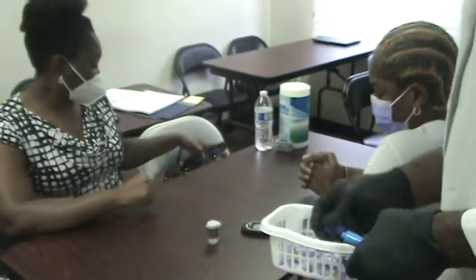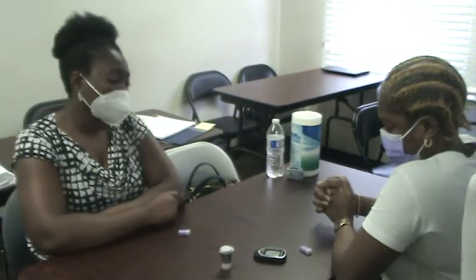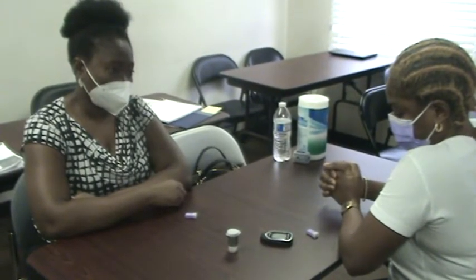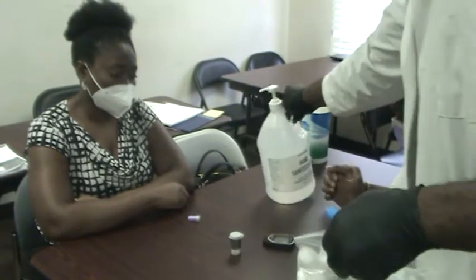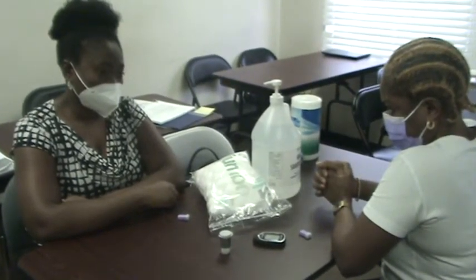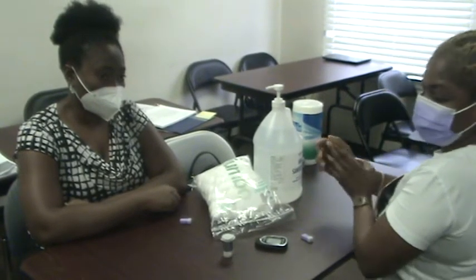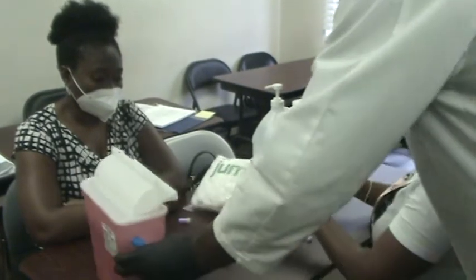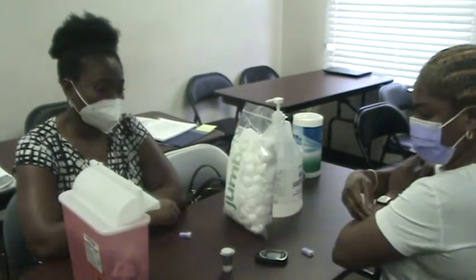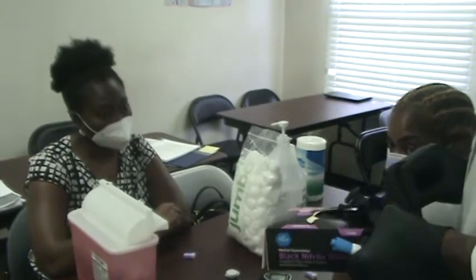You will need the alcohol. Cotton. You will need a container. That's where anything blood or sharp goes in there. Hold on. Let me give you all what you need first. So you're gonna need a pair of gloves.